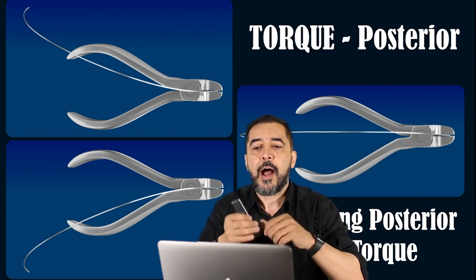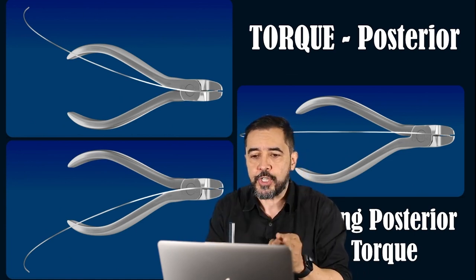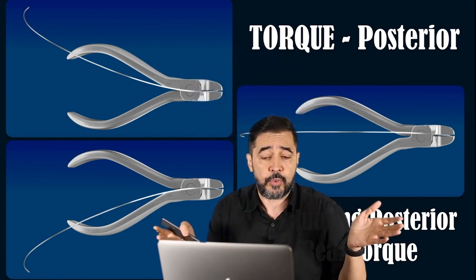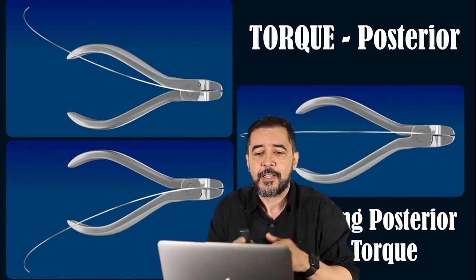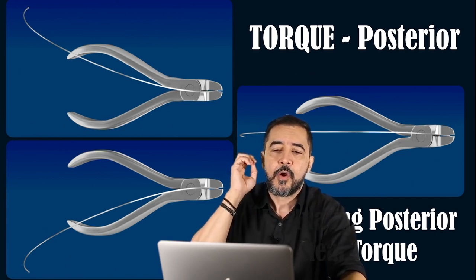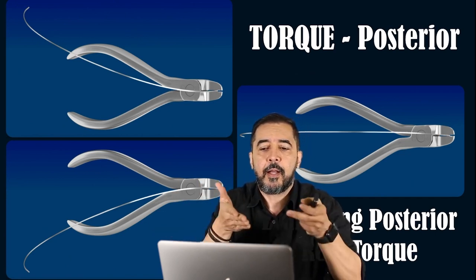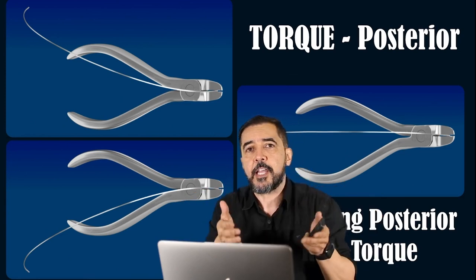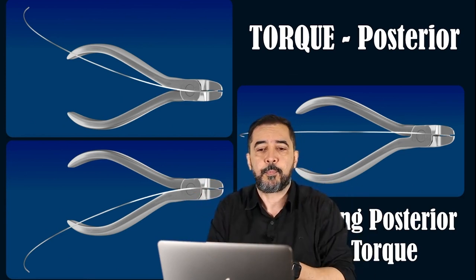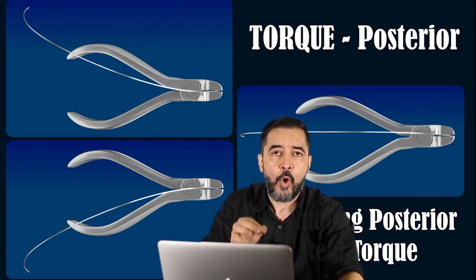Okay, so I'm referring to the torsion of the arch wire, and sometimes I say the inclination referring to the torsion. Same thing for us, and we will get used to doing it this way because we refer to positive and negative inclinations, which we do all the time in our day-to-day practice. We do it all the time.